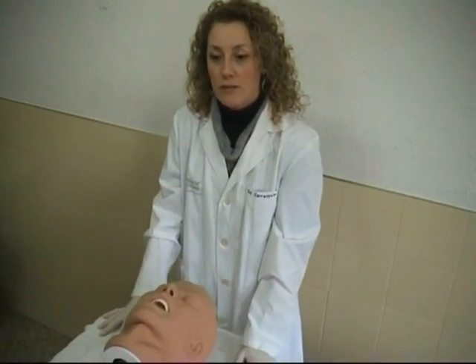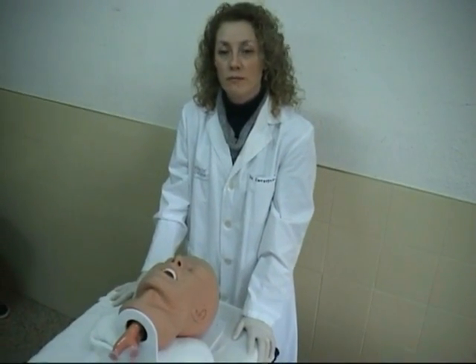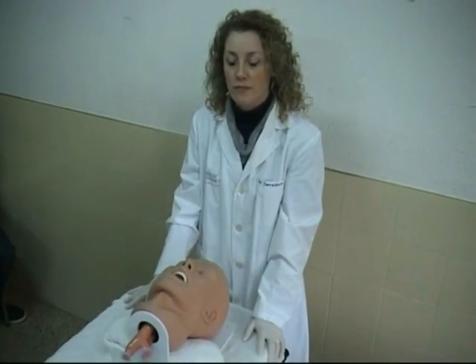In addition, the student should have a general overview of the procedure used in orotracheal intubation, because this will enable them to help the operator properly. This procedure includes the following key points.